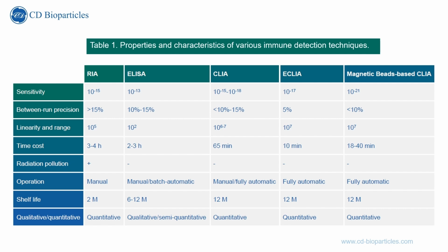While RIAs are highly sensitive assays, they are comprised of highly hazardous, radioactive reagents, which presents a significant safety risk. The handling and disposal of RIA refuse can present challenges in regulated laboratory environments and may also be costly. ELISAs are a more environmentally friendly alternative. However, ELISAs lack the dynamic range of RIAs and are not as sensitive when an analyte is present in very low concentrations. Furthermore, ELISAs often require a lengthy process, with a final reactive step necessitating the use of a stop reagent to prevent the color of each test well from continuing to develop.